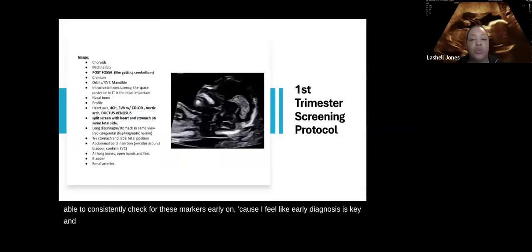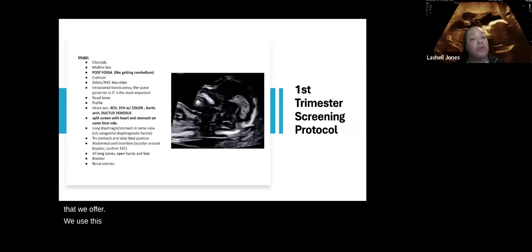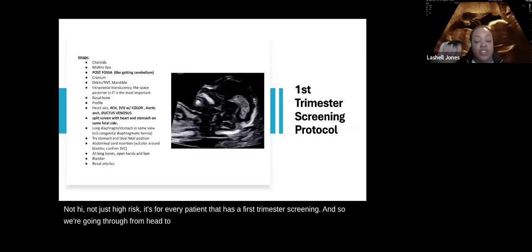I wanted to share with you an example of a first trimester screening protocol that we offer. We use this protocol as standard for every patient, not just high risk, every patient that has a first trimester screening. We go from head to toe and we're just checking off.